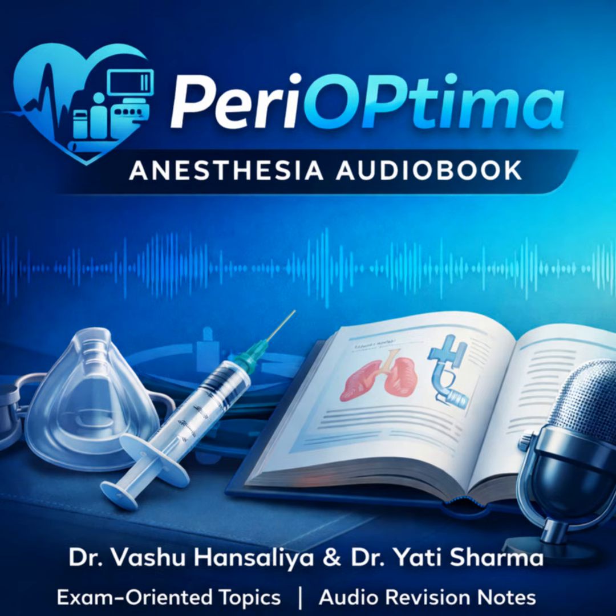But the key assumption is that the machine knows what gas is in that line. Correct, and that is the fatal flaw. They do not protect against the most insidious hazard, cross-connection upstream. Explain that failure mode. If the main O2 pipeline in the hospital is accidentally connected to an N2O source, say in a storage room or during installation, the pressure remains high. It's still 50 psi. So the pressure failure device thinks everything is fine. It sees adequate pressure and stays wide open. But in this scenario, the machine is physically delivering N2O through the O2 line. The patient gets 100% N2O, and the machine provides no alarm at all because the pressure is fine. And that limitation highlights why you need the pre-use machine check and the O2 analyzer.